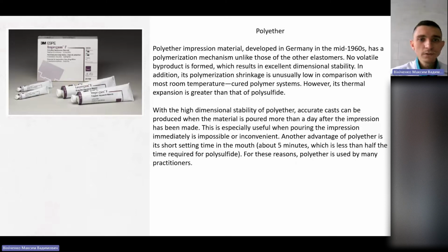This is especially useful when pouring the impression immediately is impossible or inconvenient. Another advantage of polyether is its short setting time in the mouth. For this reason, polyether is used by many practitioners. So the use of the polyether nowadays is the best choice.